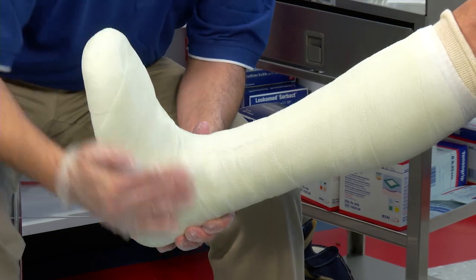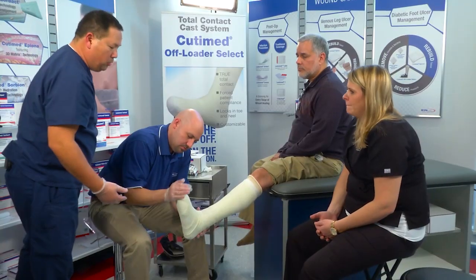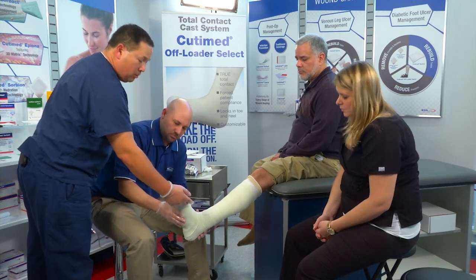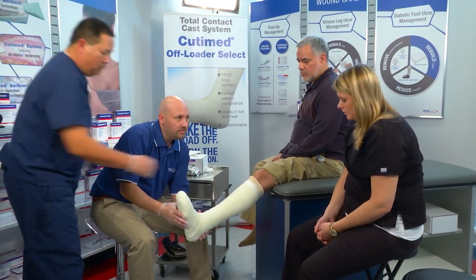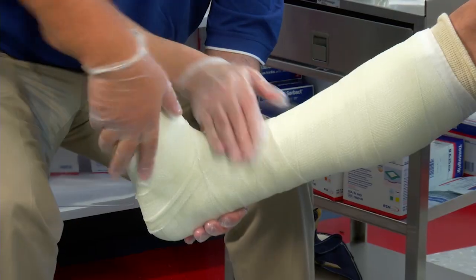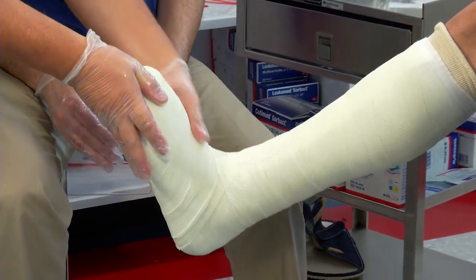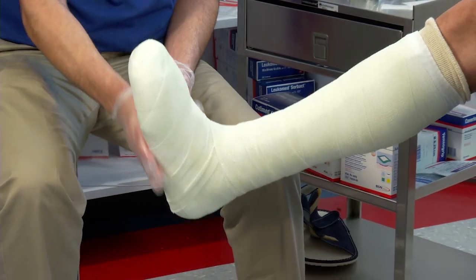If your patient weighs 240 pounds or more, the next roll — which would be another three-inch roll — would start from the metatarsal heads going distal to proximal. Notice that we've already done that, it's all smoothed out. Keep laminating that in.